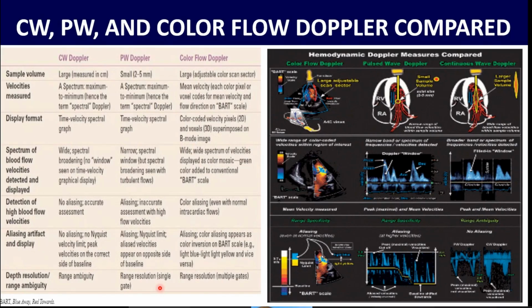The color flow Doppler, especially when you're talking about mitral regurgitation, is influenced by technical factors as well as hemodynamic factors. That is, if you are mapping the color flow area during anesthesia, the color flow signals will be much less as compared to the awake conditions. So we have to take into account all the factors which are responsible for a correct assessment of a given regurgitant jet area.